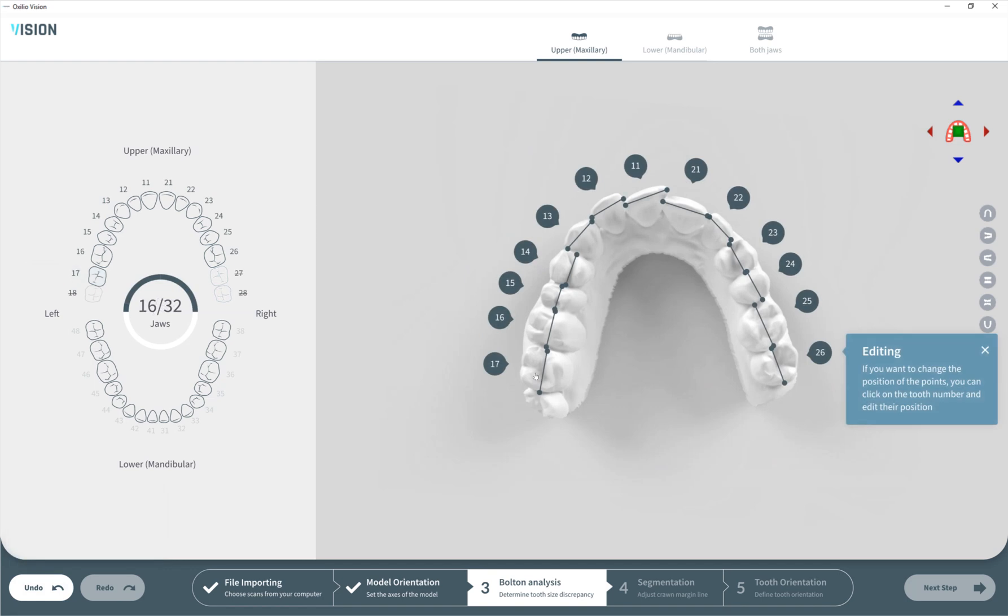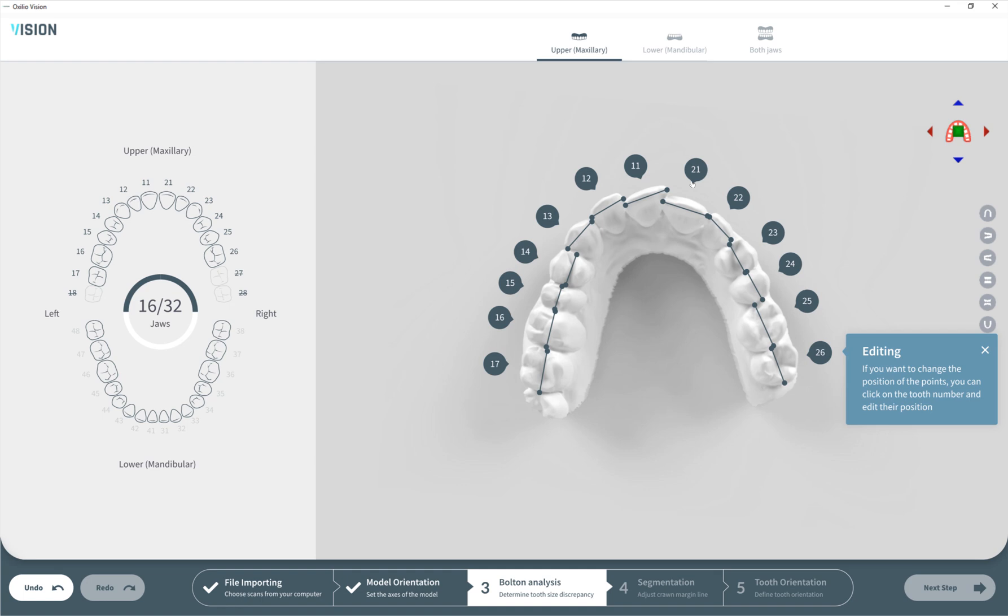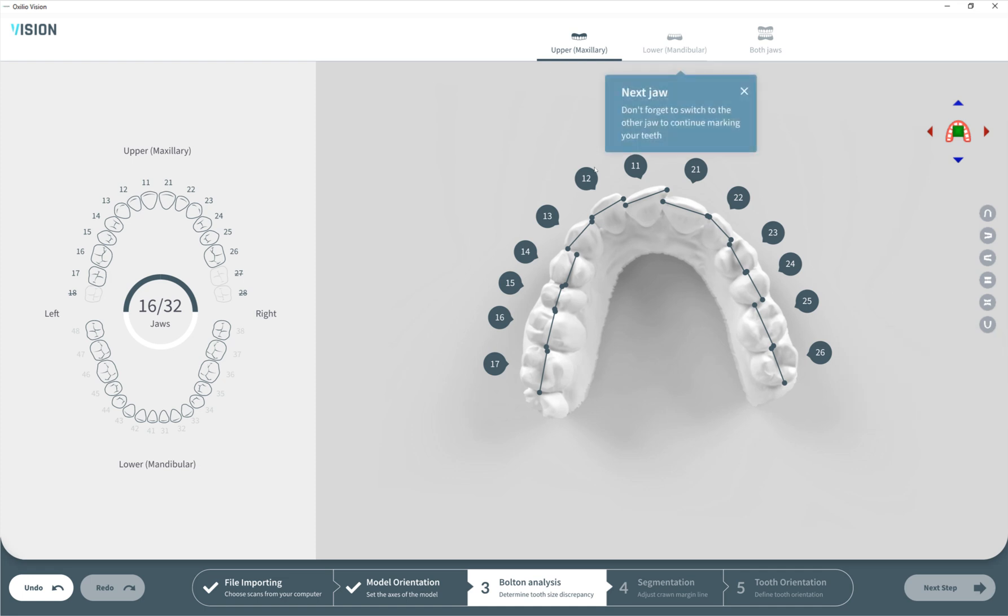After putting all the double points on our teeth, we can see a map of teeth here. Those that are missing are grayed out and strikethrough. We can see numbers of teeth which helps us see exactly which teeth corresponds to which one on the scheme on the left. This helps us not make mistakes by selecting the wrong tooth numbers. We can select each of them and edit it from the inside. You cannot edit it while seeing all the lines, which helps you not make unnecessary moves or accidentally shift the points.